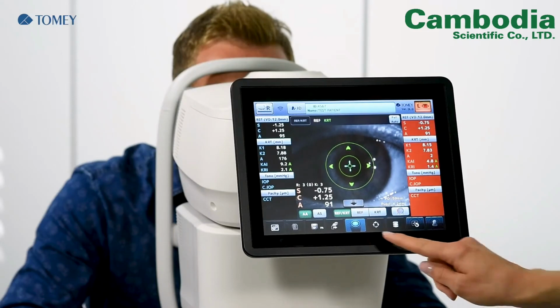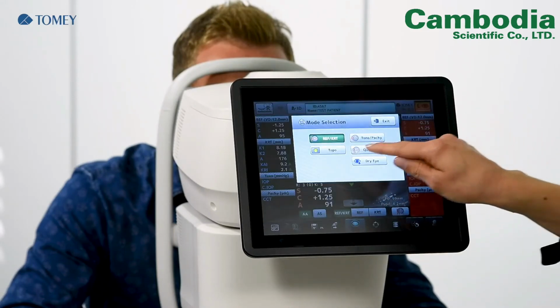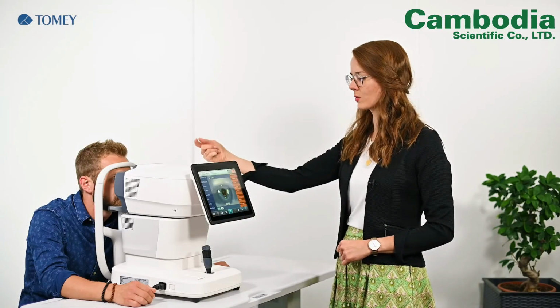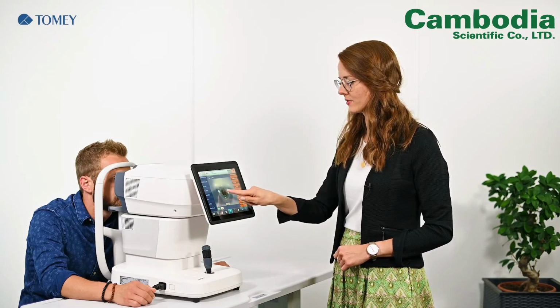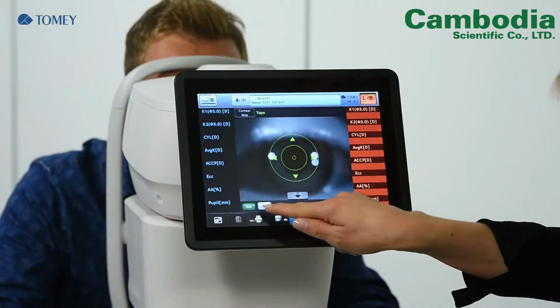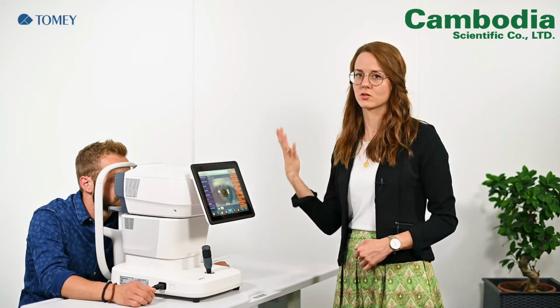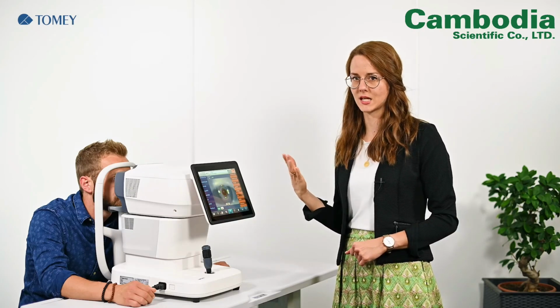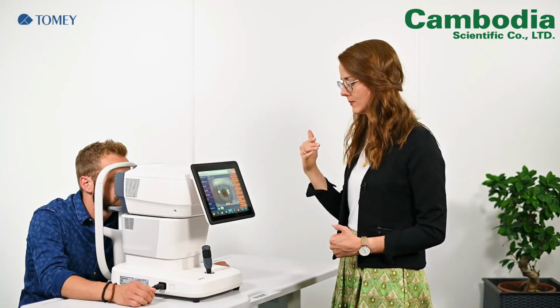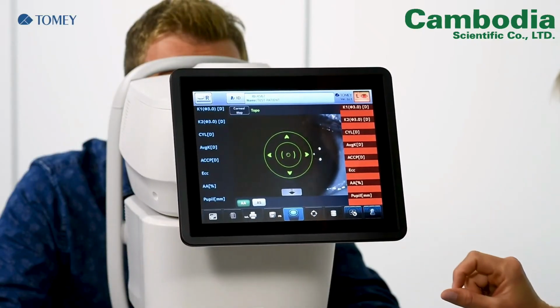We go to the mode change. This is this button below. And now we select the topography, because the topography uses the same cone for the measurement as the Refraction and Keratometer does. And here you see that the auto shot button is deactivated. This is because the patient should blink one time before the measurement is taken to have the tear film closed on the eye surface. So let's get into the focus.